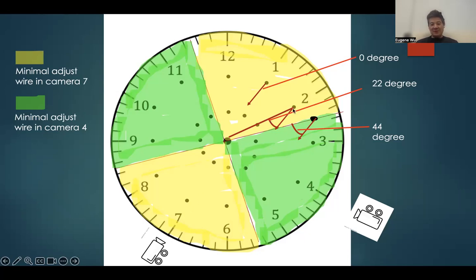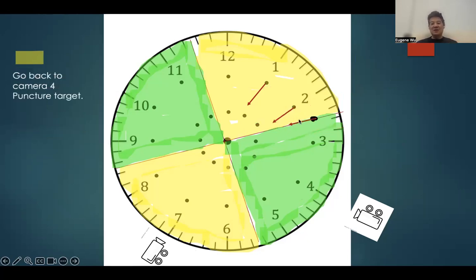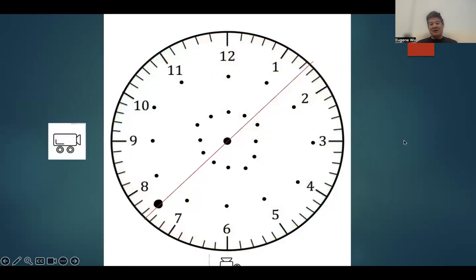On the 7 o'clock camera, the 2 o'clock cuts around 6:30. It's 2.5 minutes away from the target. 2.5 minutes divided by 5 is 1/2, so you should rotate 22 degrees. And when we rotate these angles, what we get is the wire points exactly at the distal cap. Now, I've done this for all different types of model. I've tried to put the distal true lumen on the side of the vessel, the cameras at 6 o'clock and 9 o'clock, and the red line now is the equal distance line.